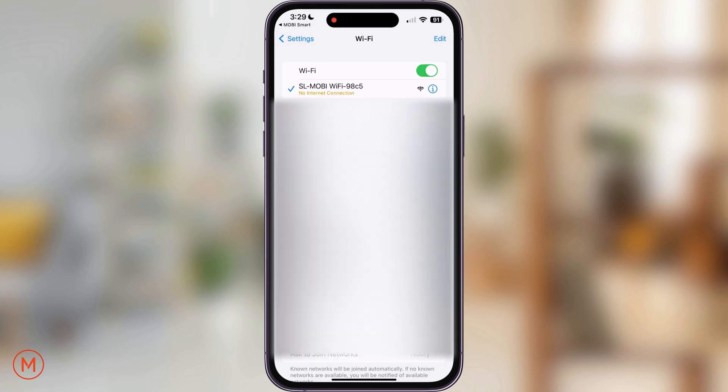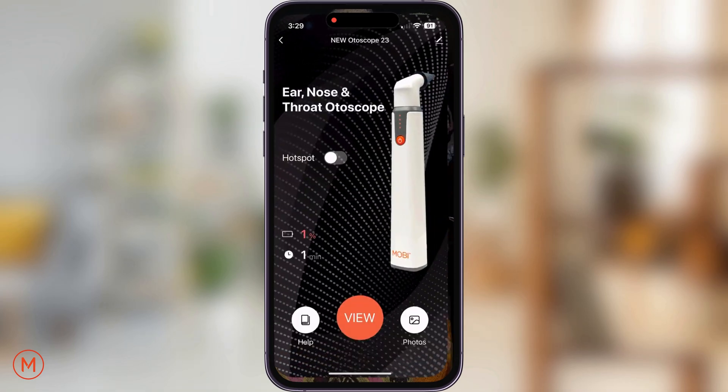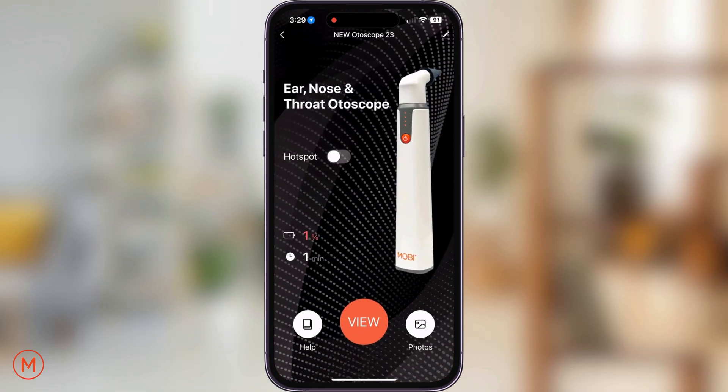Once successfully connecting to the Autoscope's hotspot connection, return back to the Mobi Smart app. Please allow 15 seconds for the device to sync with the new network. You'll notice that the status bar for the hotspot will switch from gray to orange. Once the status bar switches to orange, tap on the view button and your Autoscope is now ready to use.